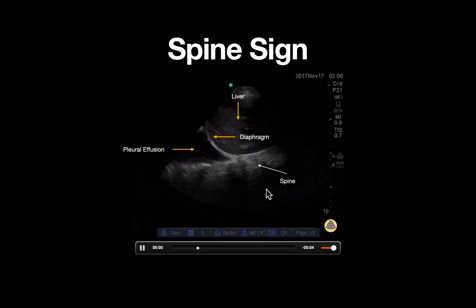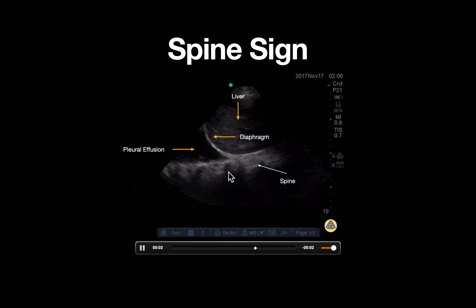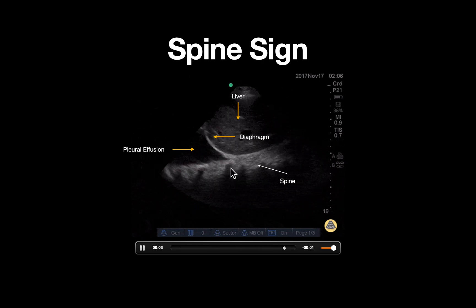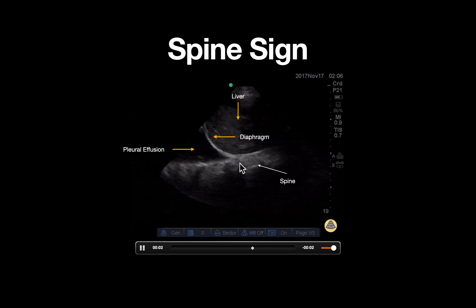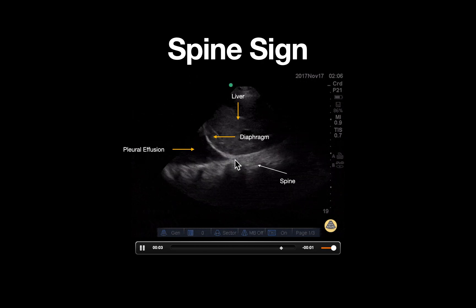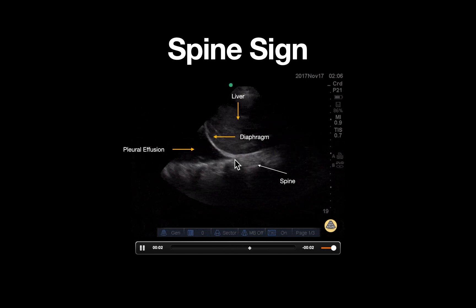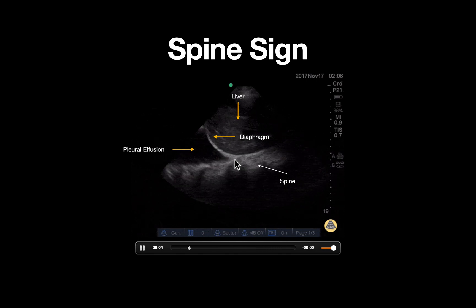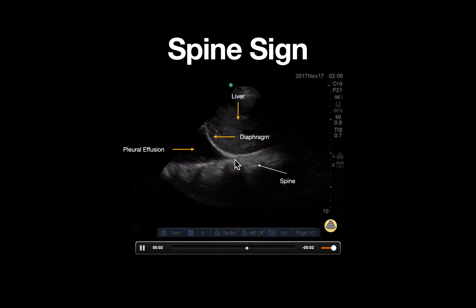Now let's focus in on the spine. In a normally aerated lung, the spine should not be able to be visualized past the beginning of the diaphragm. That's because ultrasound waves cannot travel through air and are scattered, preventing imaging of any deeper structures.